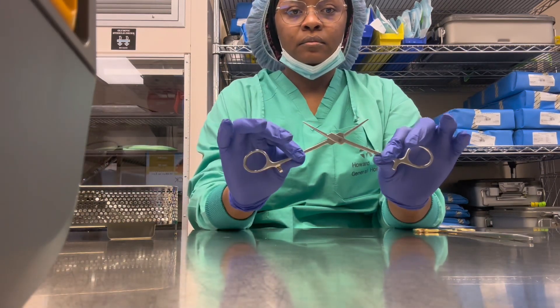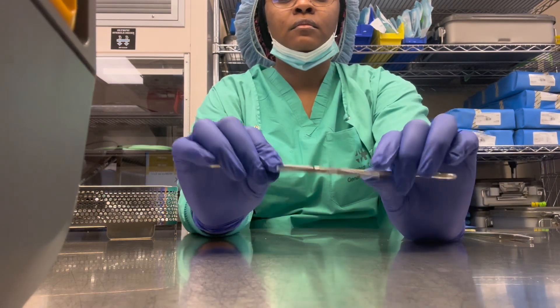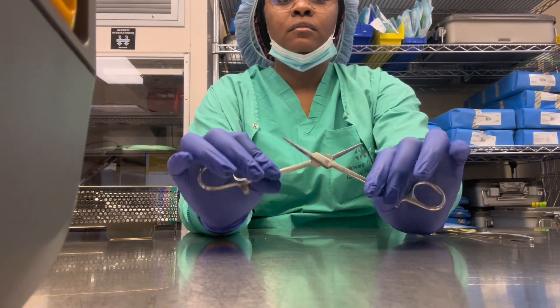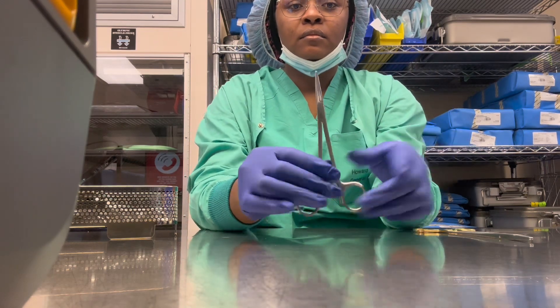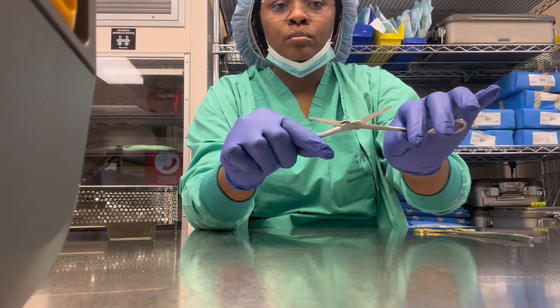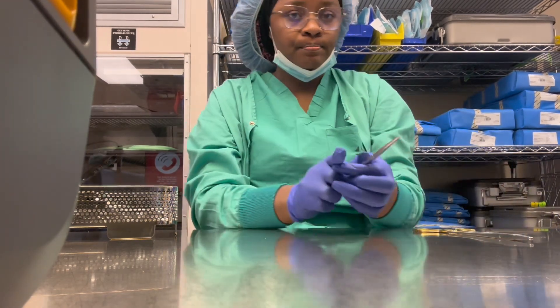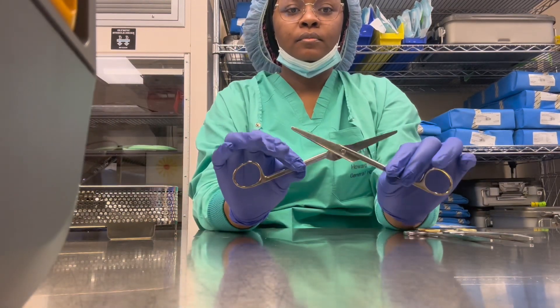The next instrument is a straight Kelly — in other hospitals you call it a straight hemostat. When you open it up, it has teeth inside. As you can see when I touch them, they do have teeth inside. This is the straight hemostat. Always make sure your instruments are clean.